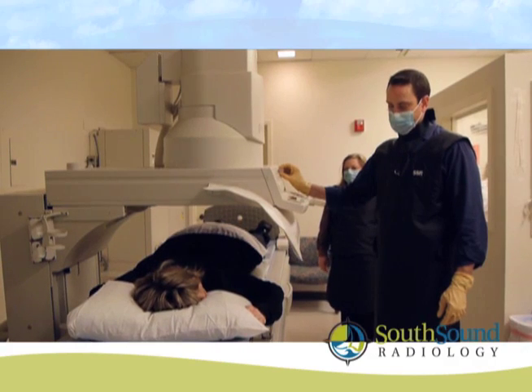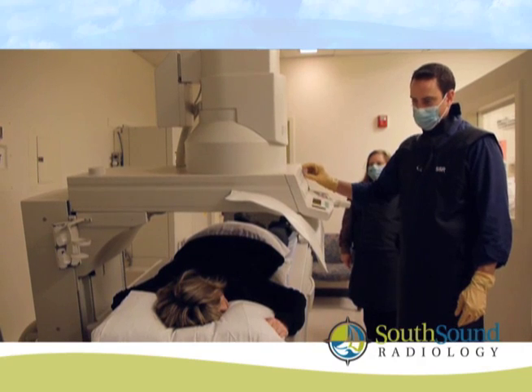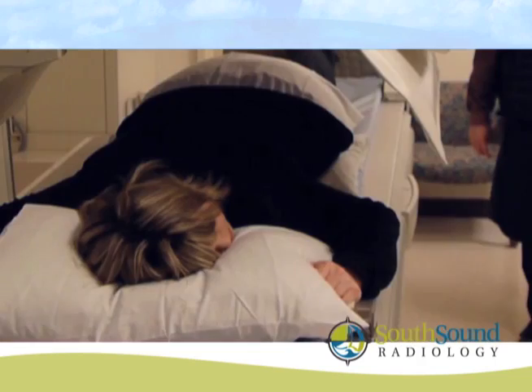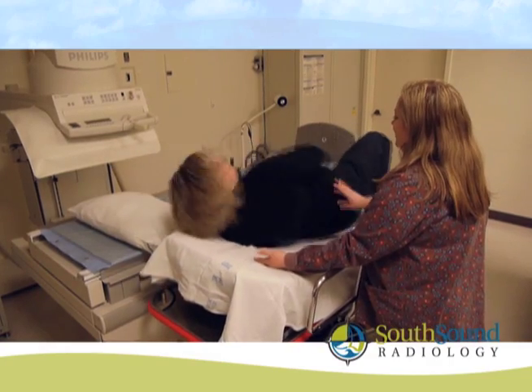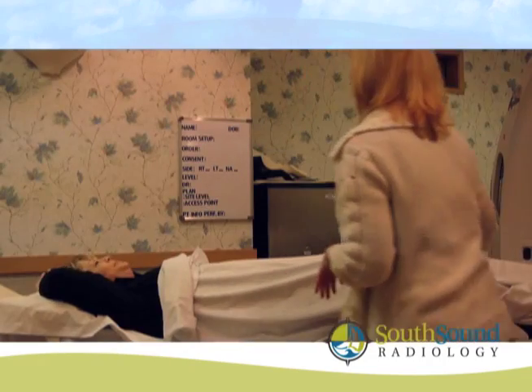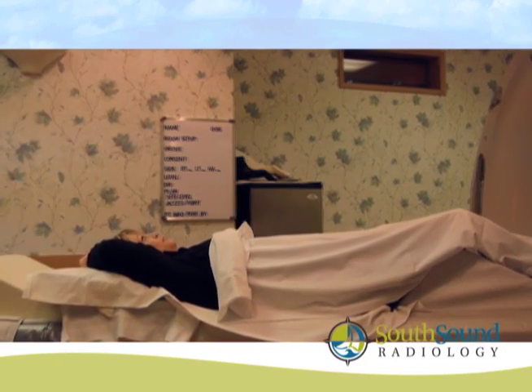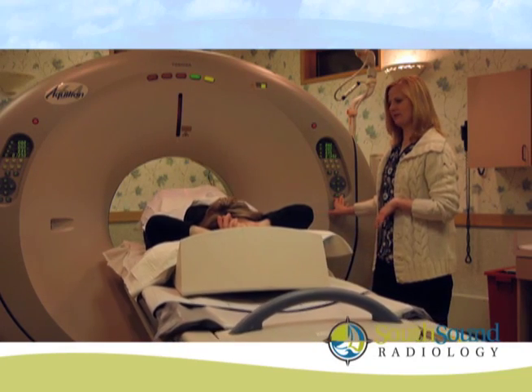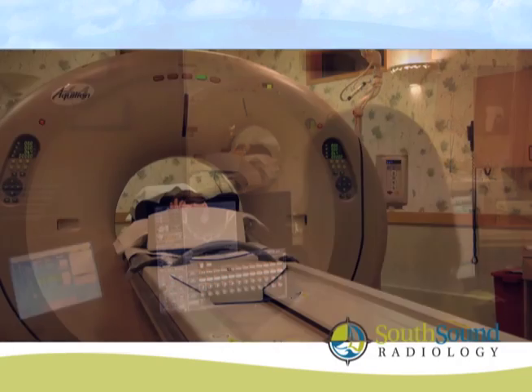The radiologist slowly tilts the X-ray table, allowing the contrast material to surround the nerve roots or spinal cord. As the table is tilted, the radiologist monitors the flow of contrast, focusing on the area that correlates with the patient's symptoms. You will then be transferred to a stretcher and moved to the CT area. While on the stretcher, you will be asked to turn over to ensure the contrast continues to surround the spinal canal and nerve roots. You will then be positioned on your back in the CT scanner. The scan will take less than 5 minutes, during which you will be asked to lie still. The technologist or radiologist will monitor you post-injection before you leave.